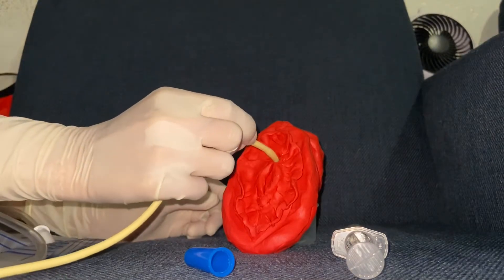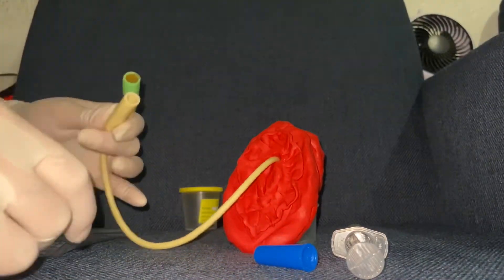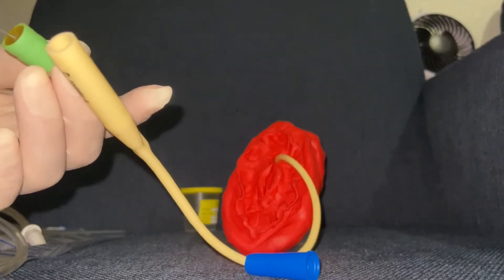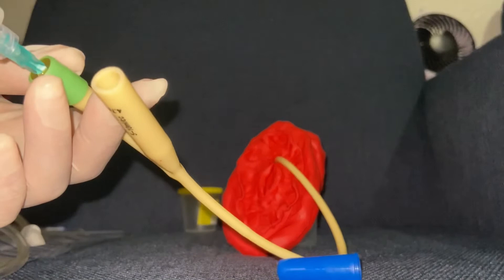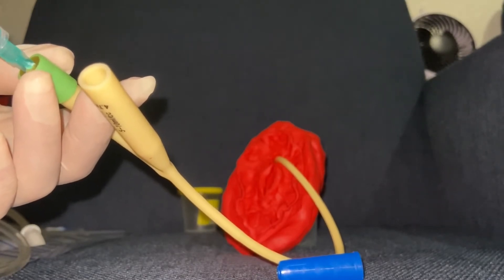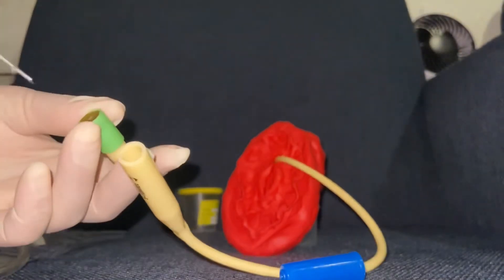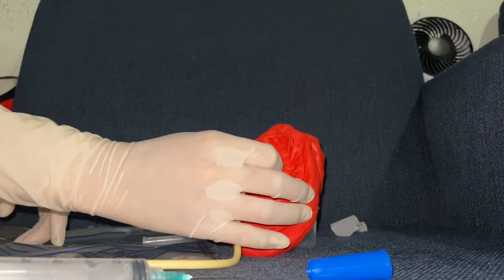Gently insert the tip of the catheter about 2 inches, very gently and slowly, or until urine starts to flow. If there is resistance during insertion, instruct the client to do deep breathing and rotate the catheter gently until urine starts to flow. Then inflate the balloon by introducing sterile water into the injection port of the catheter. Pull the catheter gently afterwards to feel the resistance.